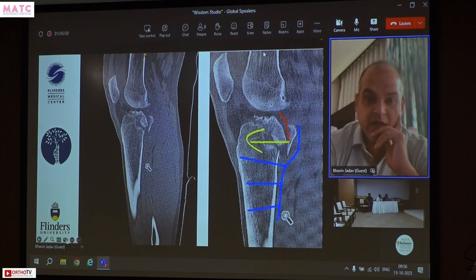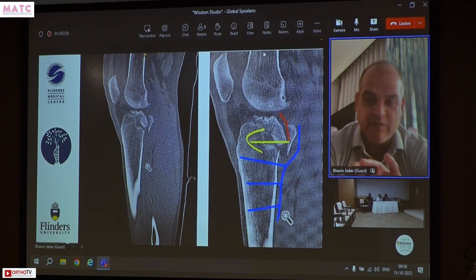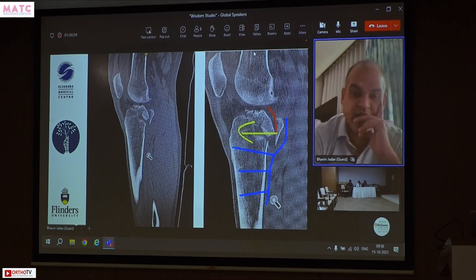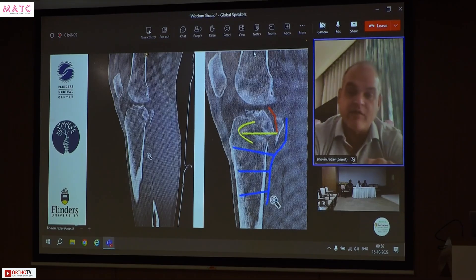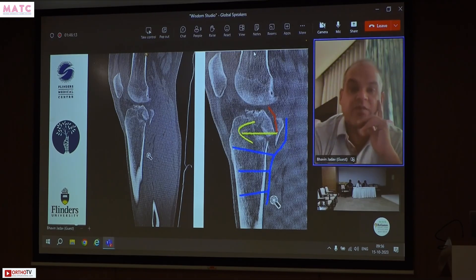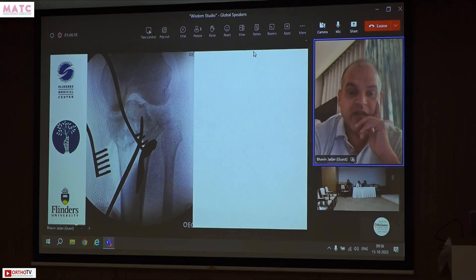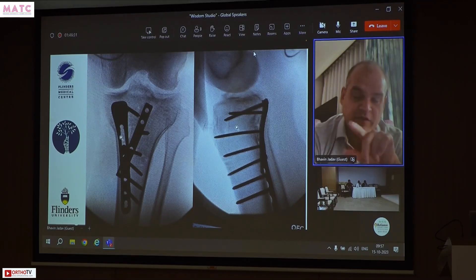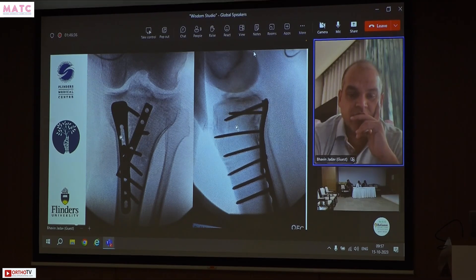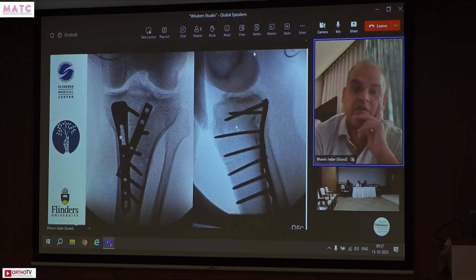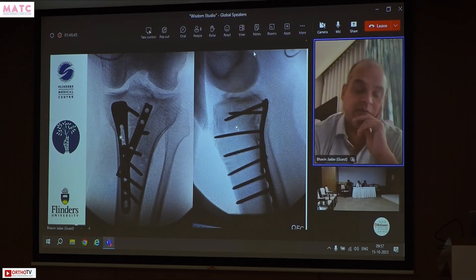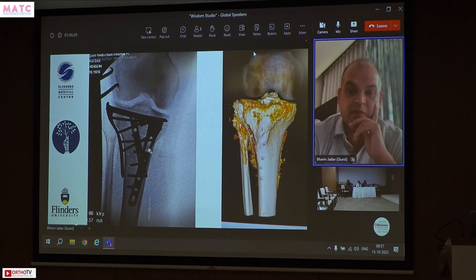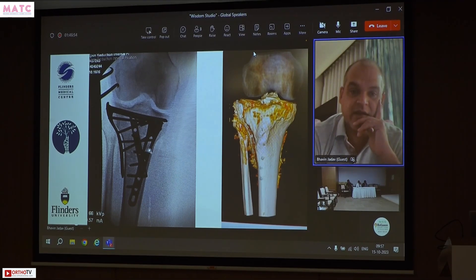In another case, the articular fragment is stuck in and angled down. To reduce it appropriately, you must lift the posterior cortex before buttressing down the posterior corner. With the patient prone, you access the apex of the fracture, push the fracture up, and put a containment plate — a one-third tubular spring plate going obliquely. You can feel right up to the fibular head with your fingers, and that oblique plate buttresses the very lateral-posterior side of the fracture, sprung under the posteromedial tibial plate. The lateral plate adds additional value with rafting screws.